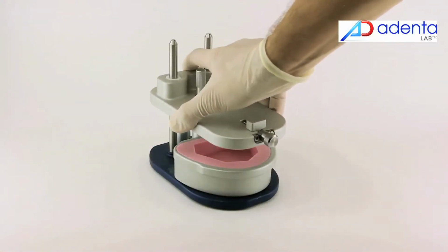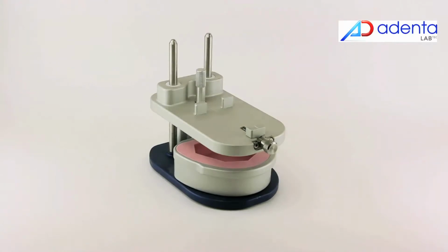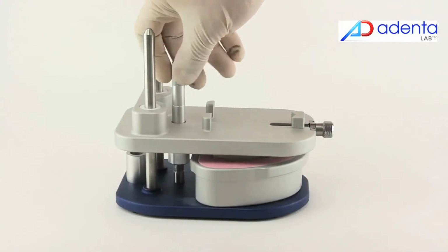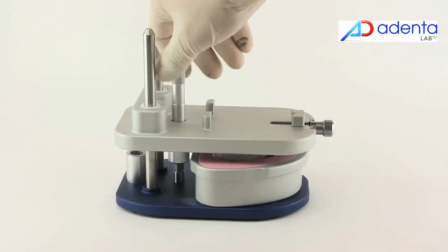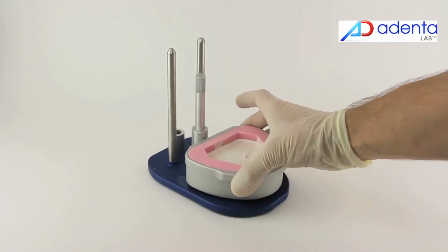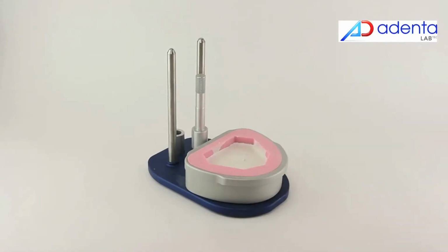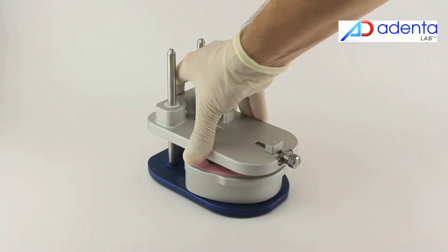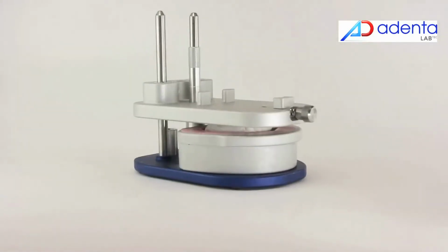The positioning plate is placed on the guiding axis and height is adjusted using the height adjusting screw according to the indications of an orthodontist. Then the plaster is poured in 4/5 of the silicon mold and the upper model is positioned. In this way, practically there will be no plaster recess.